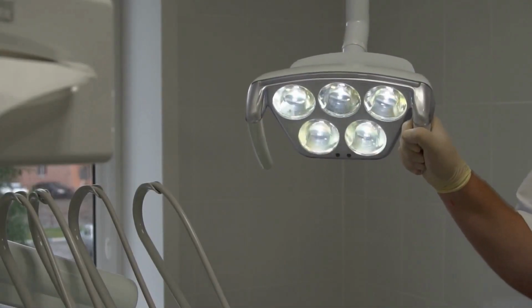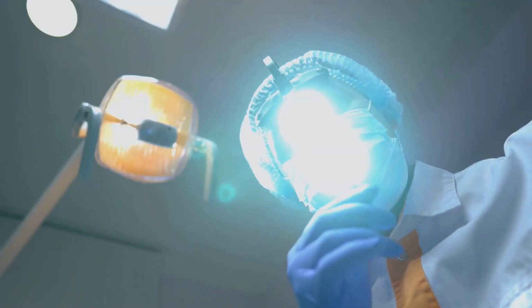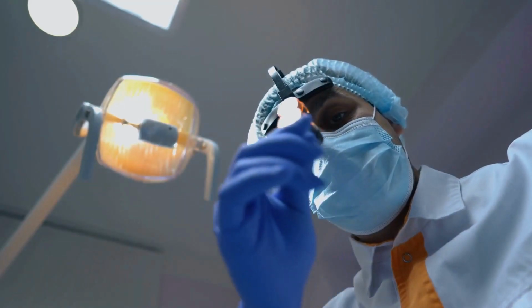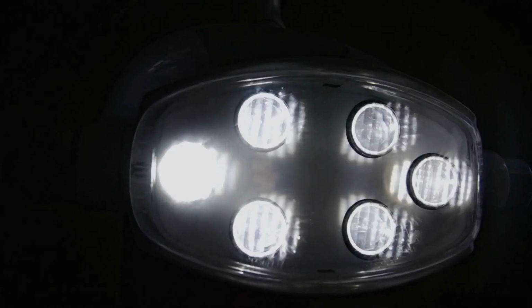Imagine shining a flashlight on a smooth, polished surface. The light bounces off directly, creating a bright glare that obscures the surface details. Now, imagine shining the same flashlight through a polarized filter onto a textured surface. The light, now polarized, interacts differently with the texture, creating a pattern of light and shadow that reveals the surface details. This is essentially what happens in cross-polarized photography, except instead of a flashlight, we use a specialized light source, and instead of a textured surface, we have the intricate structures of teeth and oral tissues.